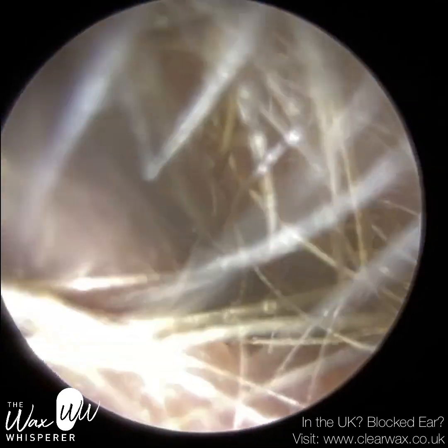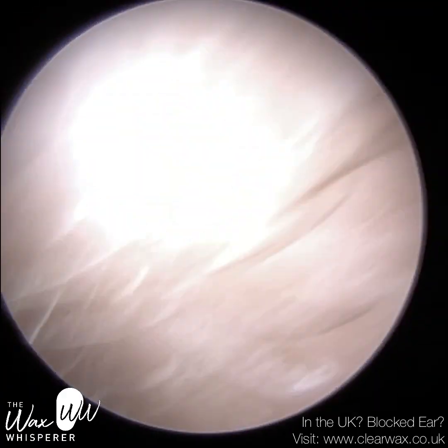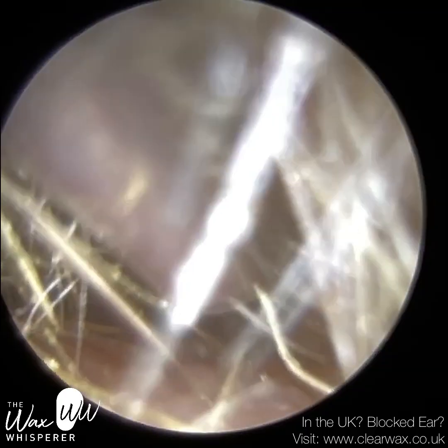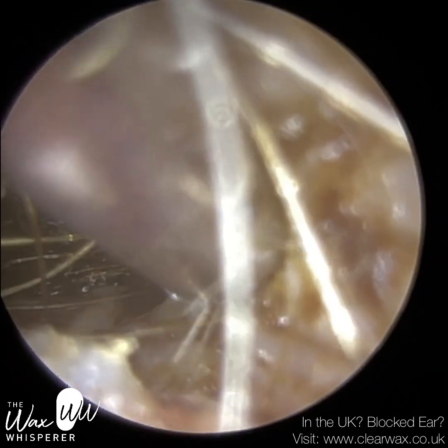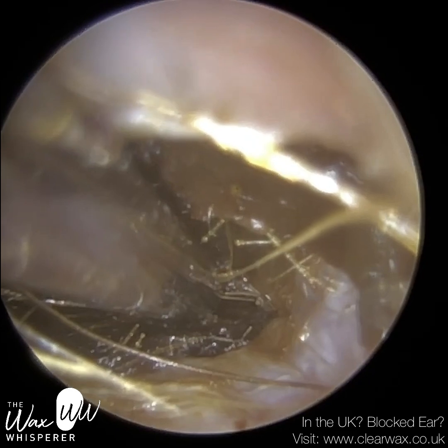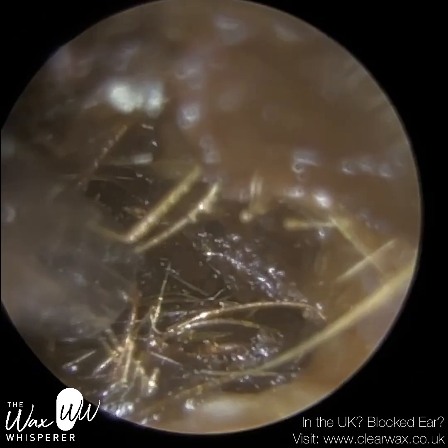So what can happen, you might have just noticed it there, the ear canal collapsed a bit. As I'm going into the ear canal, because the fluid in the swelling of the cells is attracted to the sucker, the ear canal itself is attracted to the sucker, and it can cause the ear canal to collapse. So you've got to be really, really careful when you enter. So I just came back out there, slowly re-entered. A fine end suction probe can help in cases of a collapsing ear canal because there's less suction. However, it just wouldn't have been powerful enough to remove this really impacted debris.